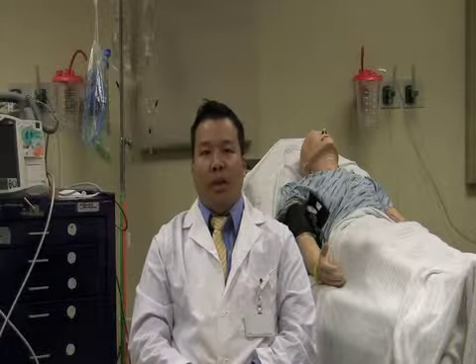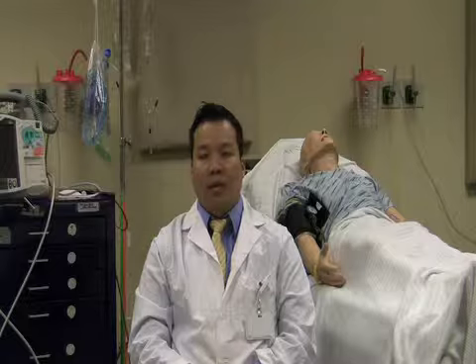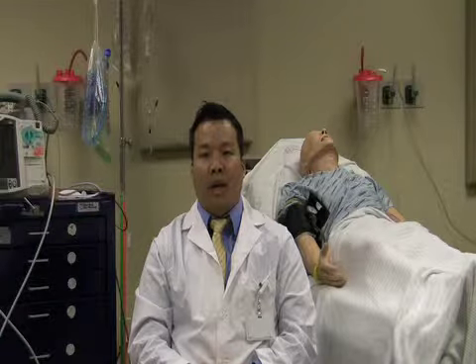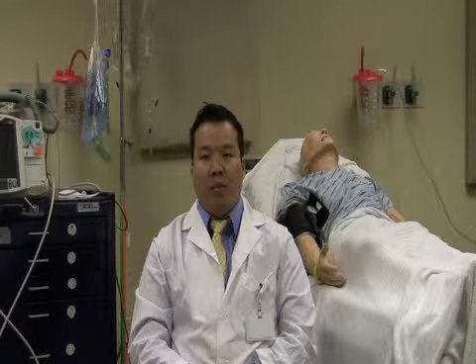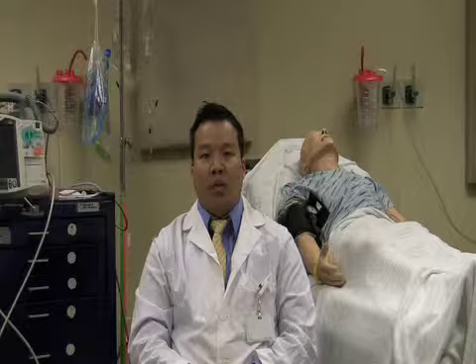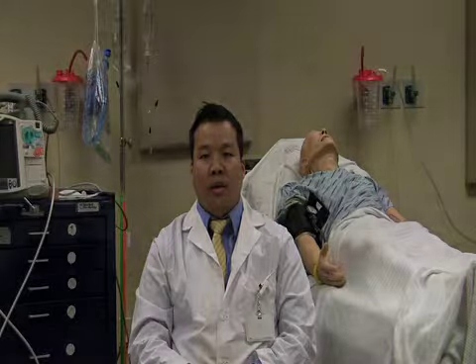For pacemakers that are firing at too rapid of a rate, this may be due to pacemaker-mediated tachycardia or runaway pacemaker. In these cases, a magnet can be placed on the patient because this will reset the pacemaker into asynchronous mode at a set rate that was previously programmed by the manufacturer.